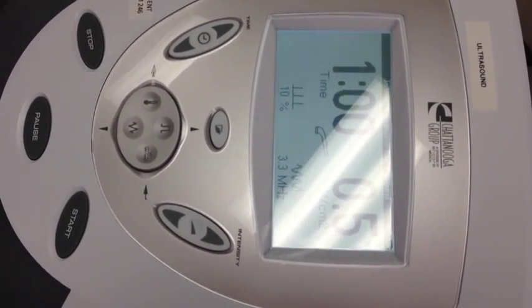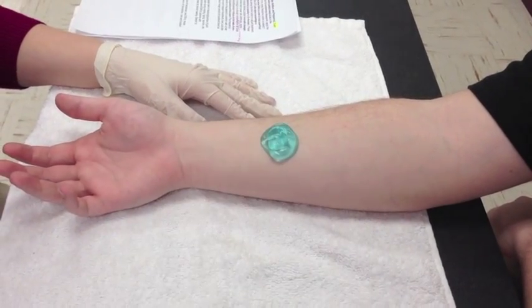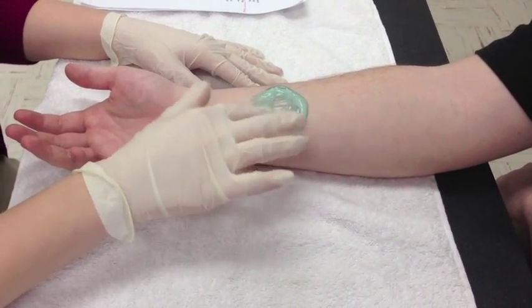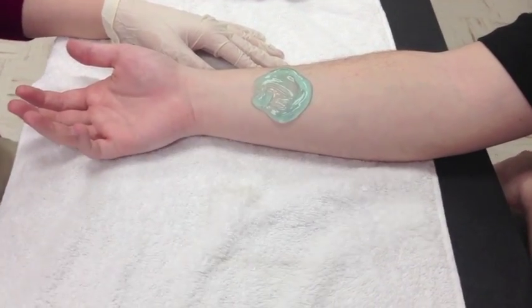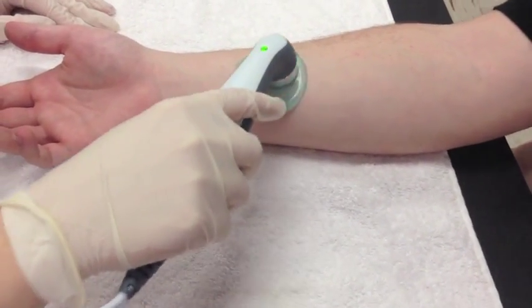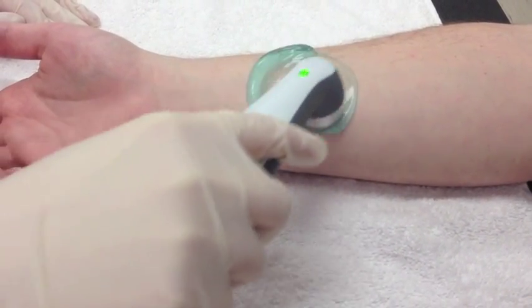Now we want to apply the medium to his skin. Now we're going to press the start button. It's right here. You want to apply the applicator to his skin, and you want to keep it moving in a circular motion so that you don't burn his skin.